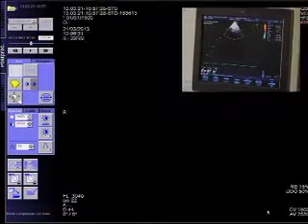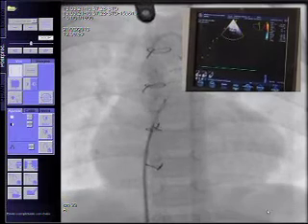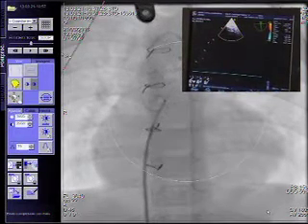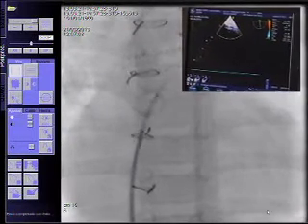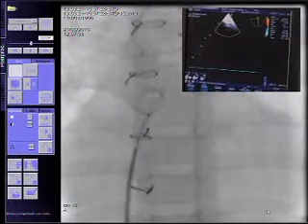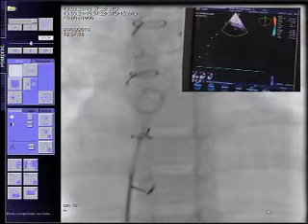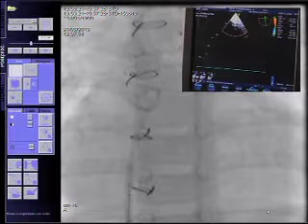No, that's okay, not so far. May I have some lupa? So, I think it's far away enough. I am retrieving the needle.